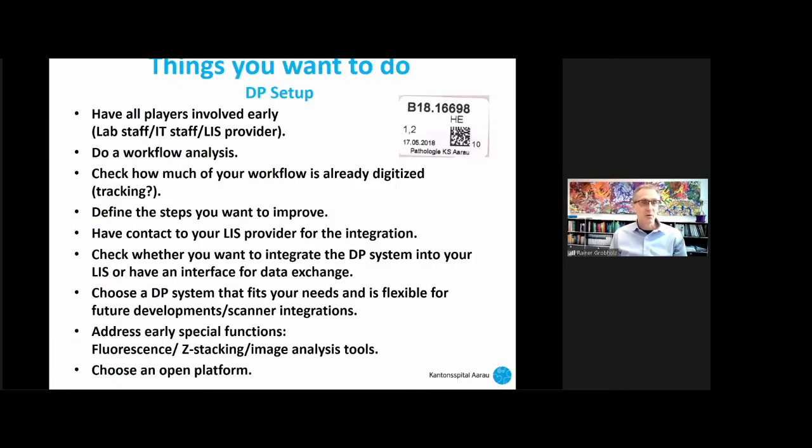So, things you want to do in a digital pathology setup. I really can recommend having all the players involved early. Otherwise, you might run into serious problems. Do a workflow analysis and ask yourself how much of your workflow is already digitized. And most important, define the steps you want to improve. That brings us to the very, very important question: what do I really want with digitization? Is it just technology, or do I want to improve something in my digital routine?